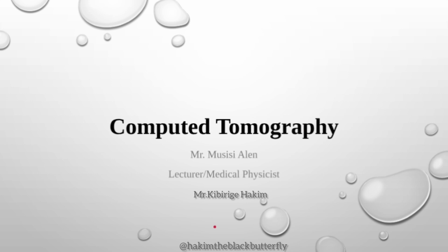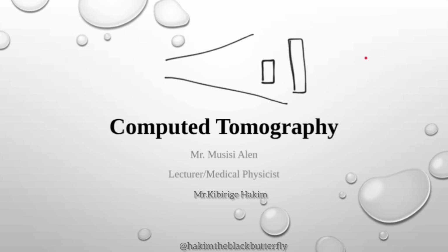Just like if we have an object here and we have another behind it. Let me say a beam of X-ray comes from this side. The final image which is created on the image receptor is this.